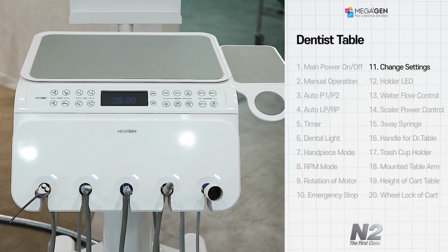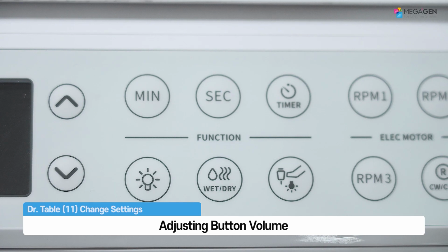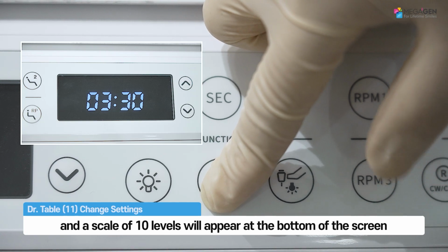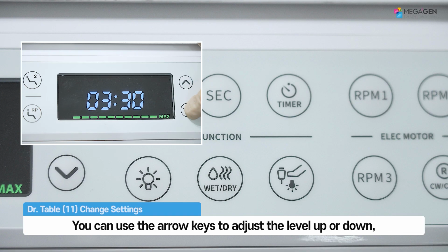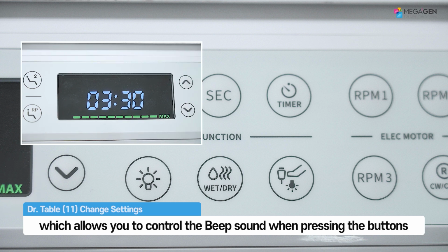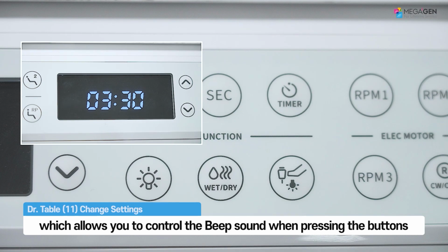Settings, adjustment mode. There are 2 adjustment modes, button volume and display brightness. Adjusting button volume. Press and hold the wet-dry button, and a scale of 10 levels will appear at the bottom of the screen. You can use the arrow keys to adjust the level up or down, which allows you to control the beep sound when pressing the buttons.